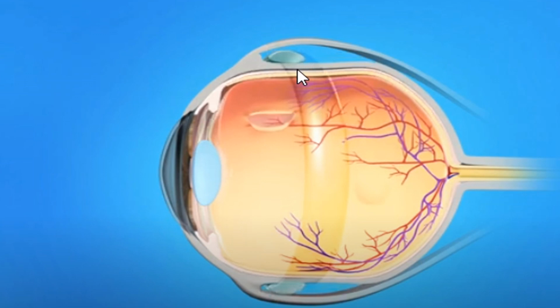Actually, it is a strong pressure and strong tightening around the eyeball. So you have ischemia to all the vessels, sure, all the vessels coming from the back of the eye to the front of it, from the posterior to the anterior segment. So you have anterior segment ischemia. When you keep pushing it, the eye is like a balloon.